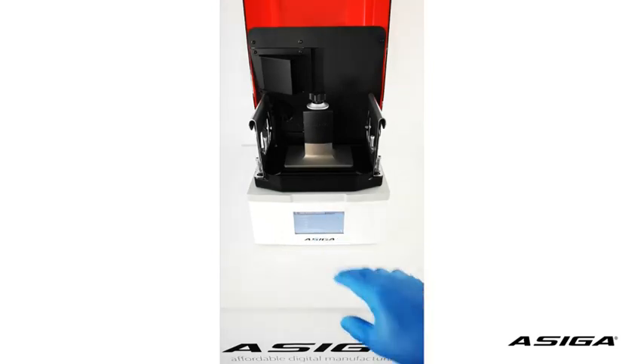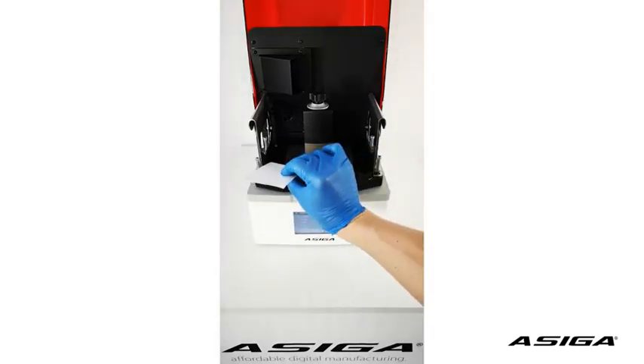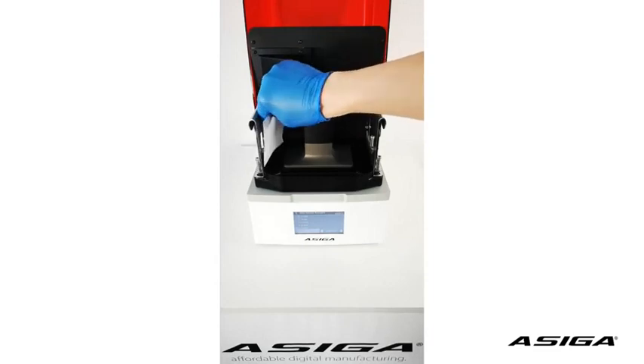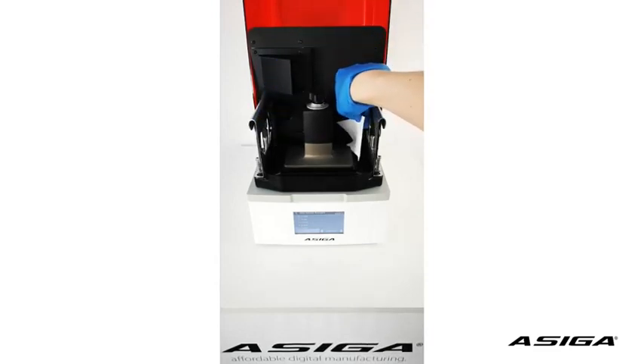In our case, this check is successful. You also want to make sure that the platform is not too far away from the glass. Use the piece of paper and check below — check if you can fit it under any of the corners. It shouldn't fit, because if it fits, your gap is larger than 100 micron and you might have problems with adhesion of prints in the first layer to the platform.